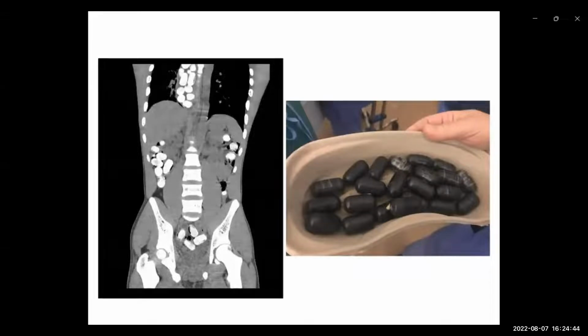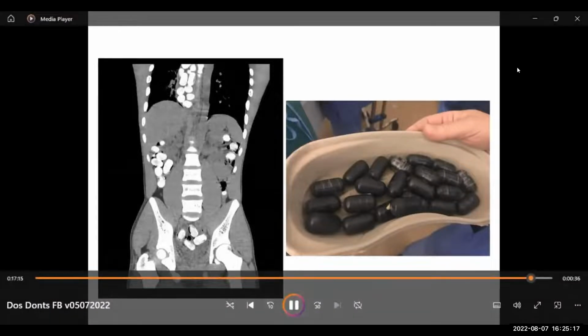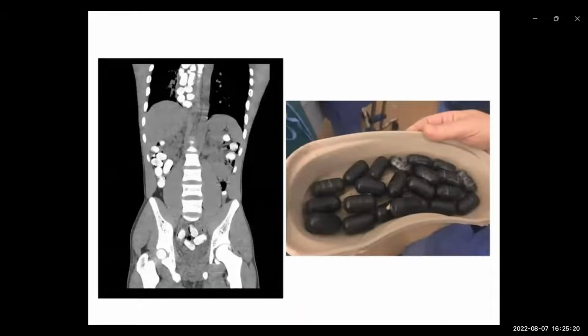The patient was admitted to the operating room at 26 hours of ingestion. The surgical team was standing by in case of a rupture. A rapid sequence intubation was performed given the aspiration risk. All esophageal packs were extracted with a retrieval net and none showed any sign of rupture. The patient was admitted to the intensive care unit for surveillance. He received laxatives to accelerate the passing of the other packs. Follow-up was uneventful.